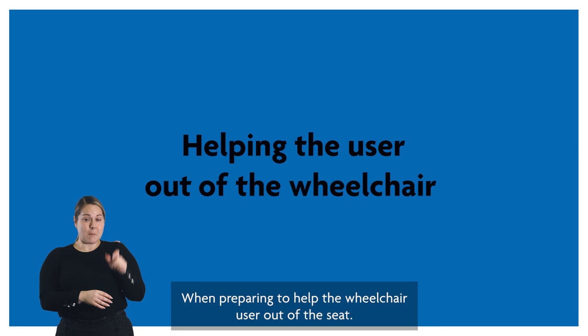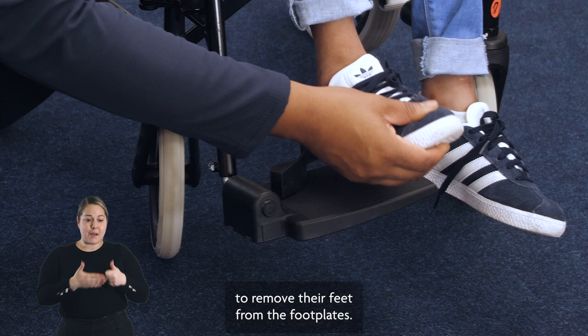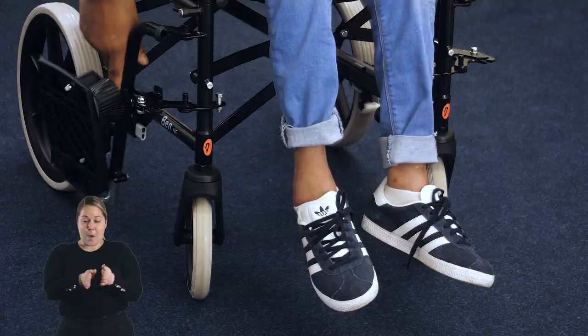Remember to communicate with the wheelchair user about what you are doing as you do it. When preparing to help the wheelchair user out of the seat, move the wheelchair as close as possible to the seat they are going to transfer onto. Lock the brakes and undo the seat belt before helping the wheelchair user to remove their feet from the foot plates.